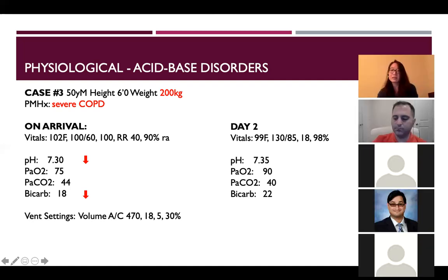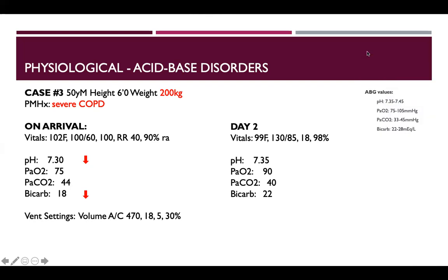I think the tidal volume is inadequate given their body weight. I'm not sure how the recommendations change for different pathologies, but isn't it usually around 6 or so mL per kg? Okay. Yeah, so we can definitely talk about the tidal volume. The recommendation is 6 to 8 based on their ideal body weight, not on their actual body weight.